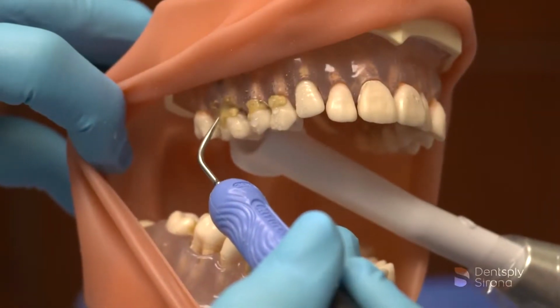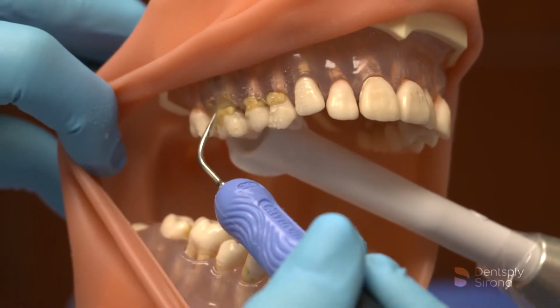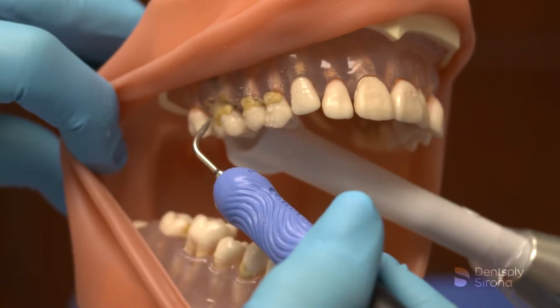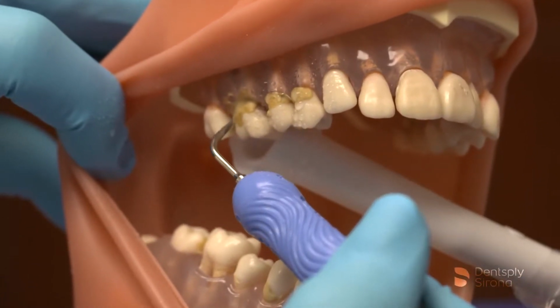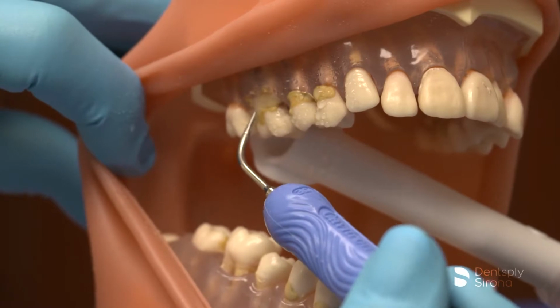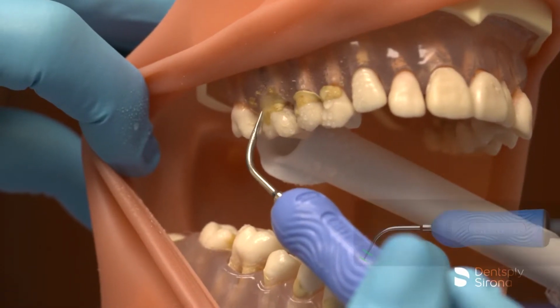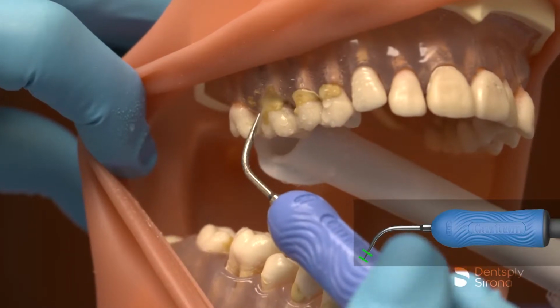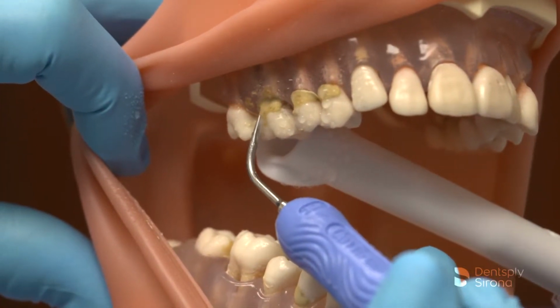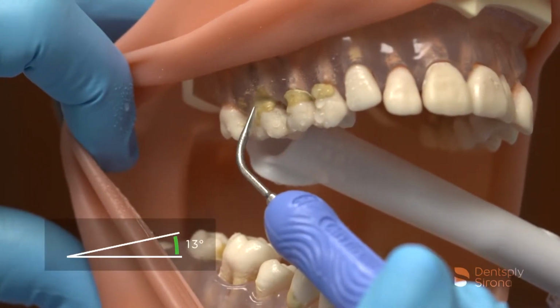The clinician begins by adapting the lateral surface of the Cavitron FSI 10 on the clinical crown and activates the foot pedal to begin the stroke. Adaptation will be in the transverse oblique approach in the healthier sulcus to prevent encountering the junctional epithelium, and in a more vertical approach as indicated. The clinician adapts 2 to 3 millimeters of the terminal end and rides the anatomy towards the gingival margin in a vertical oblique orientation while maintaining an angulation of 0 to 15 degrees.